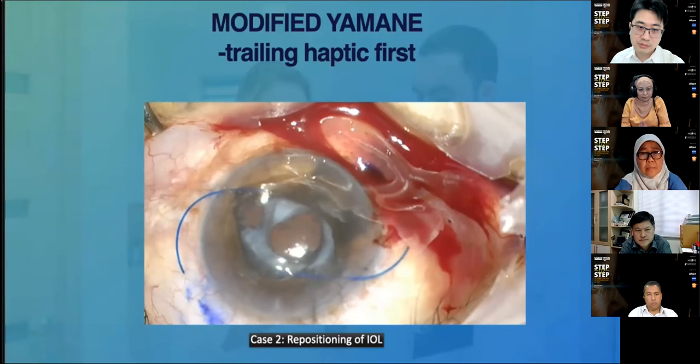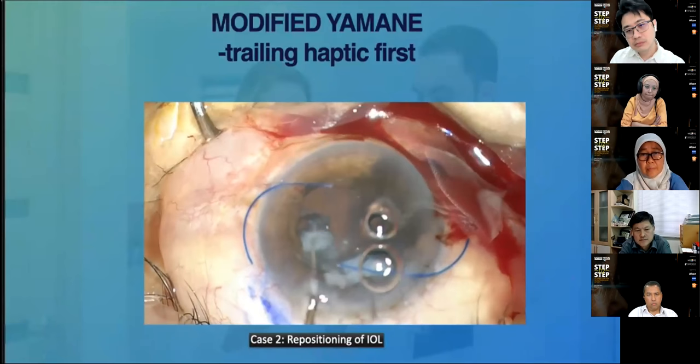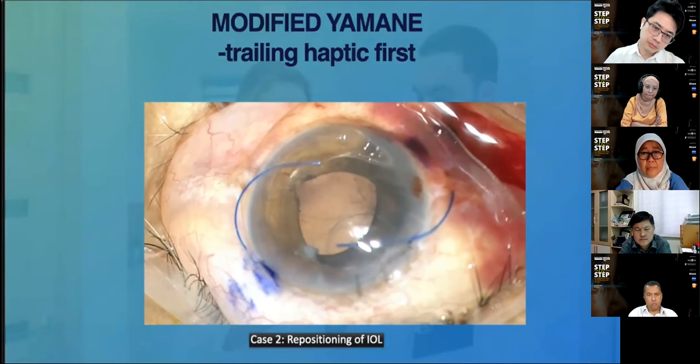And proceed with cleaning up the remaining cortex as well as the remaining vitreous. So we did the limited anterior vitrectomy in this particular case. Once we are done, we proceed with creating the tunnel for the trailing haptic. In this particular case, we decided to use the trailing haptic first.